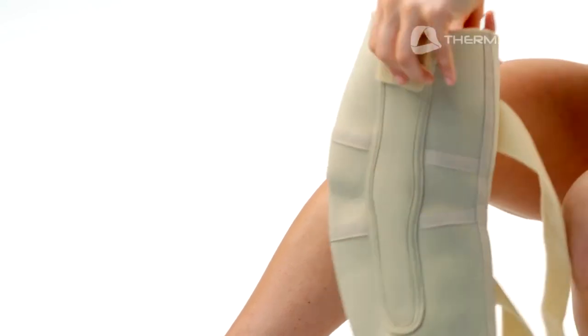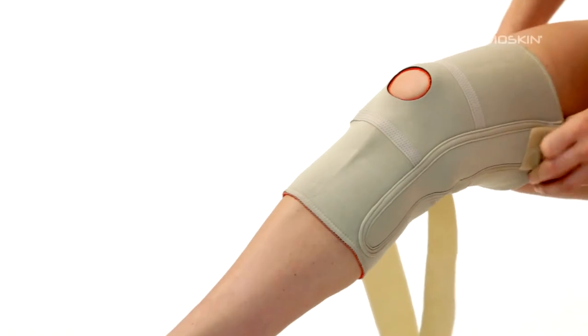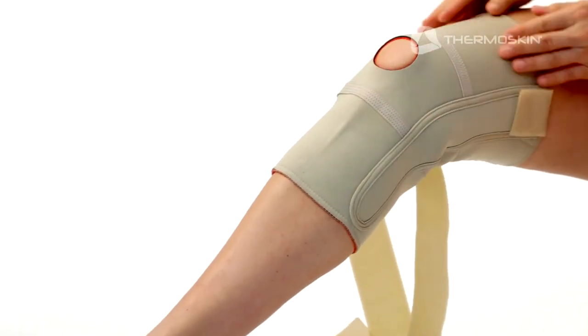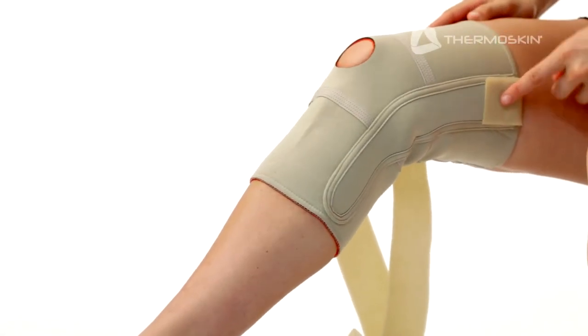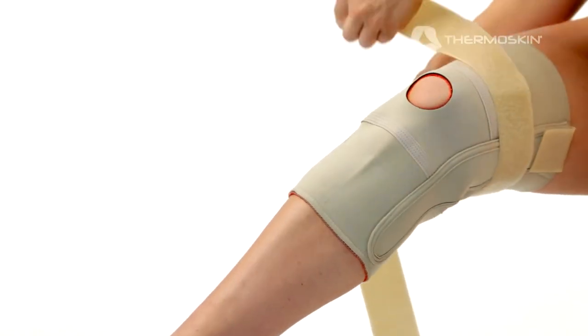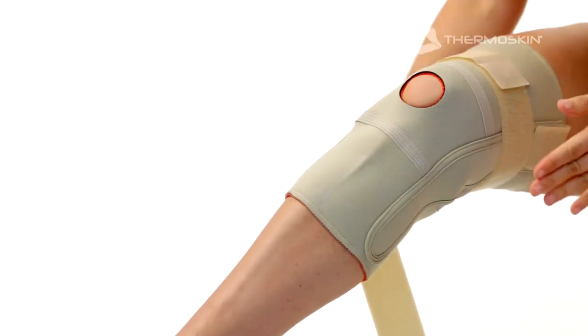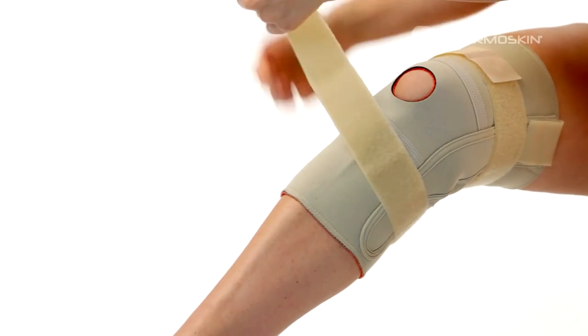With the seam at the back, slip the knee brace over your foot and slide it up over your knee. Position the patella hole in the mid section of the brace directly over the center of your kneecap. Make sure the fastener of the side hinge pockets is on the top. Then thread the top strap behind your leg, through the top buckle and back on itself, firmly securing the fastener.